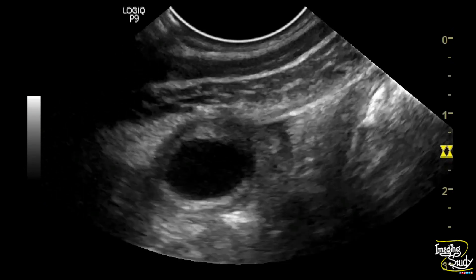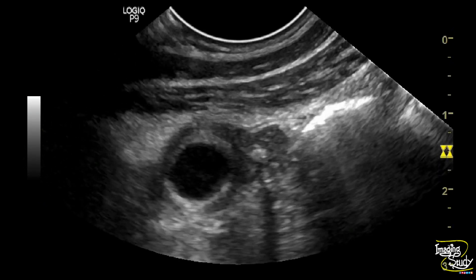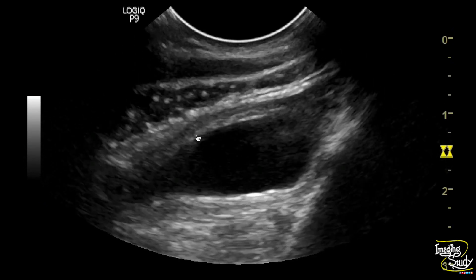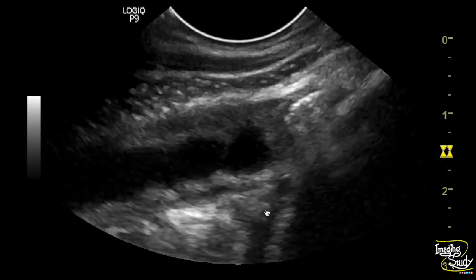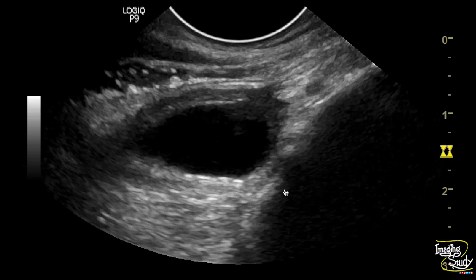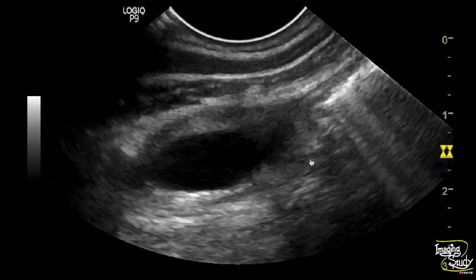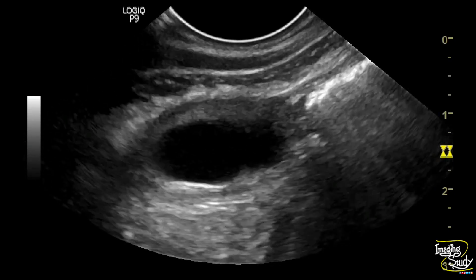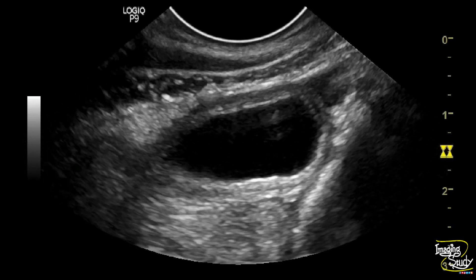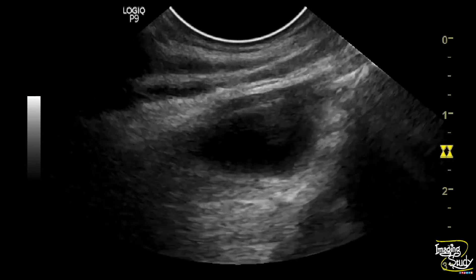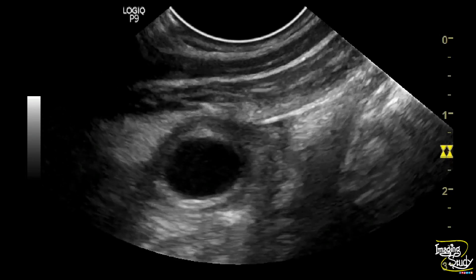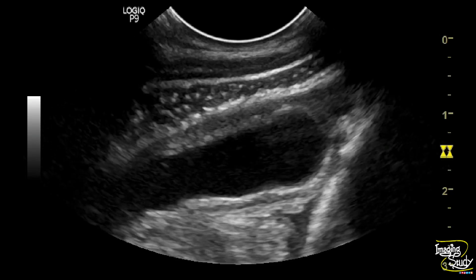Here I have used the transvaginal sonography transducer to see this lesion, and its surrounding thickening of the fatty layer is well visualized. So overall, this is a case of gangrenous appendicitis with perforation.